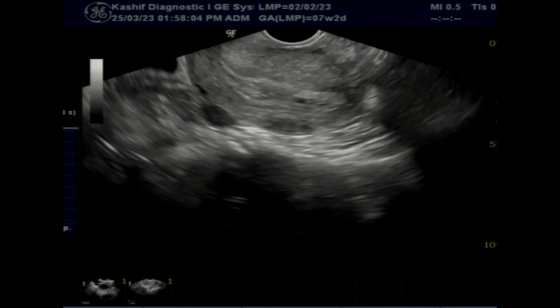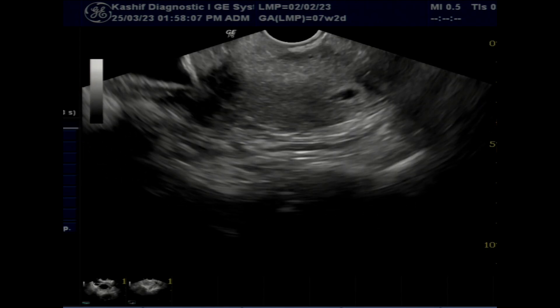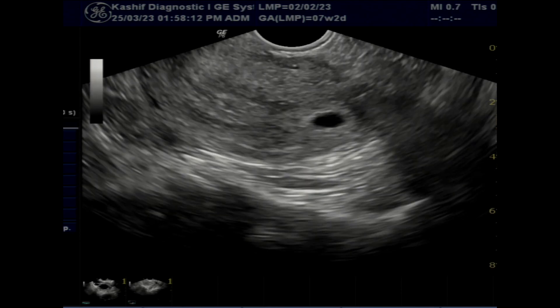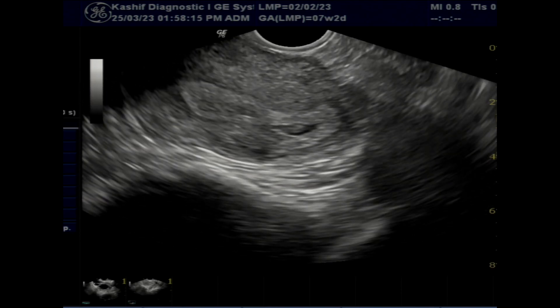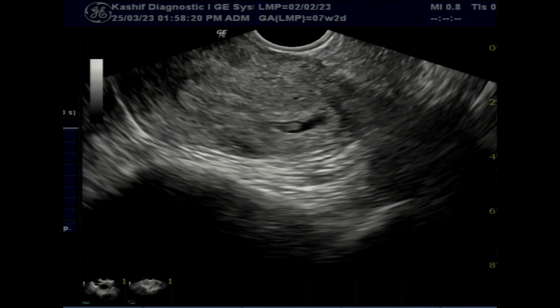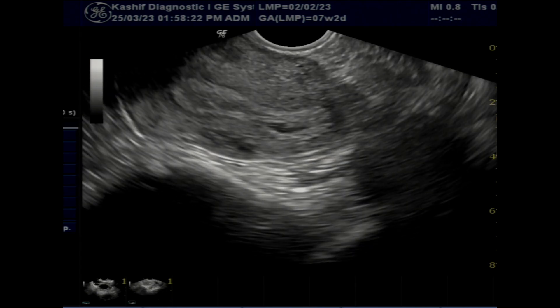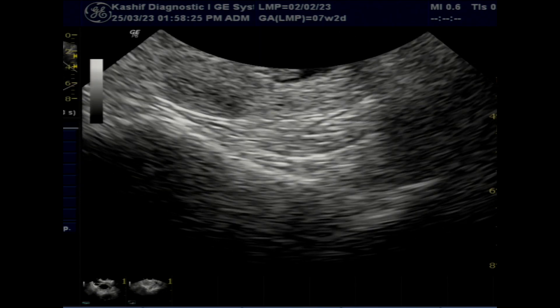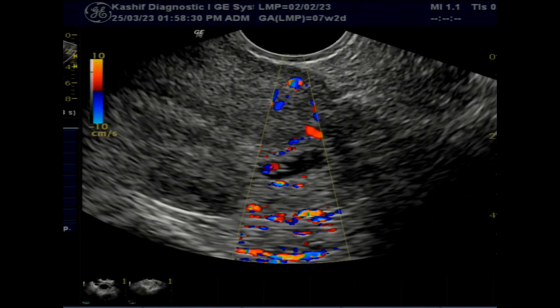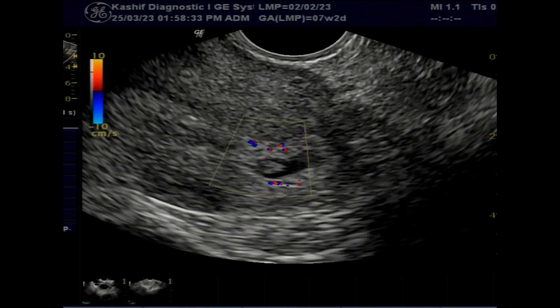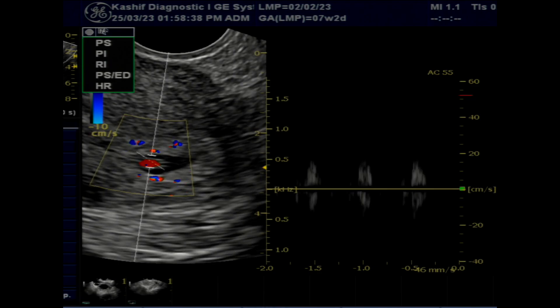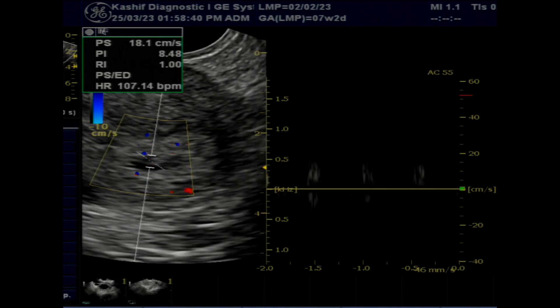A gestational sac is seen intrauterine and this sac is normal in position. The sac is mildly elongated, and a small fetal pole is seen in the sac. Cardiac activity is positive. No peri-sac fluid is seen. Normal position and absence of peri-sac fluid are good signs.